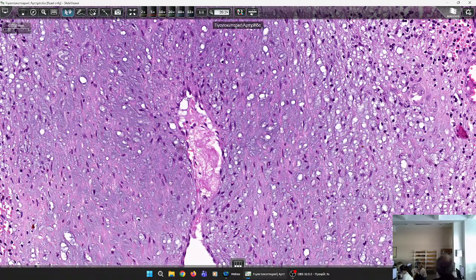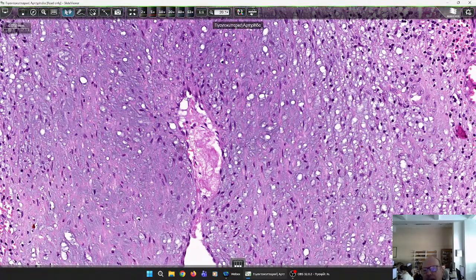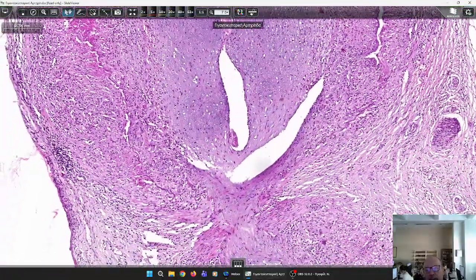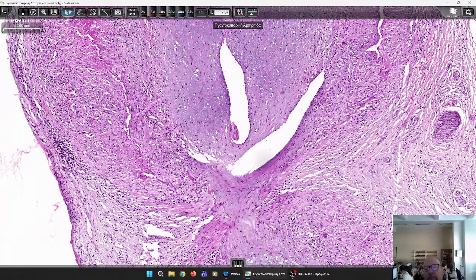And what symptom does this cause to the patient? He'll have headaches with temporal arteritis. And if other arteries are involved by the inflammatory process, he might have pain when chewing and other problems with the eye. So this is a vasculitis, and as all immune-mediated vasculitis, they may become clinically apparent by infarcts.